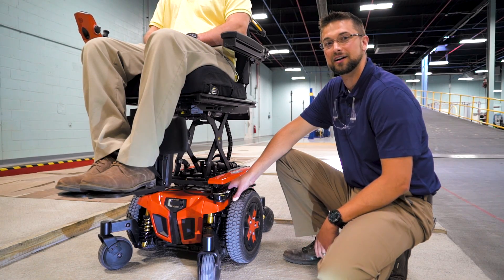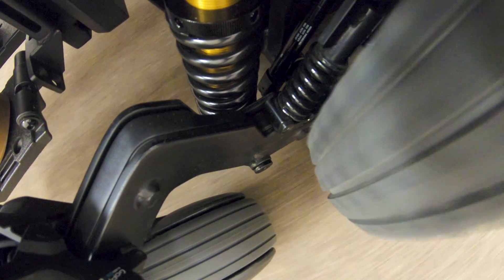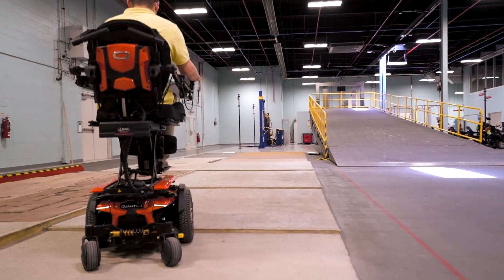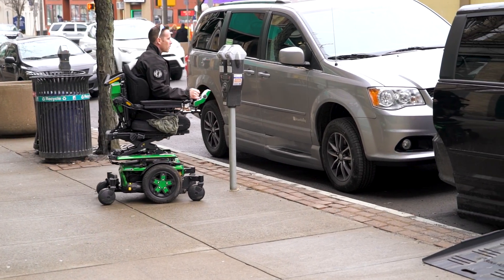So how does iLevel work? iLevel works by actuating two dual suspension lockouts. This increases stability up to 4.5 miles an hour and allows for 1.5 inches of curb climbing. The Quantum Power Chair must be on a flat, level surface to activate iLevel.